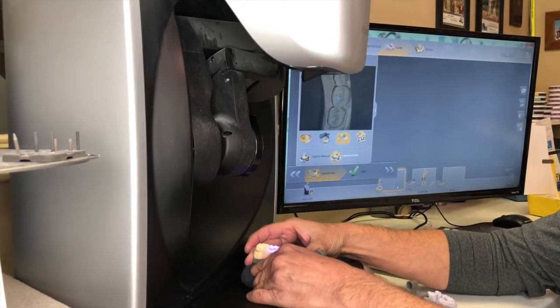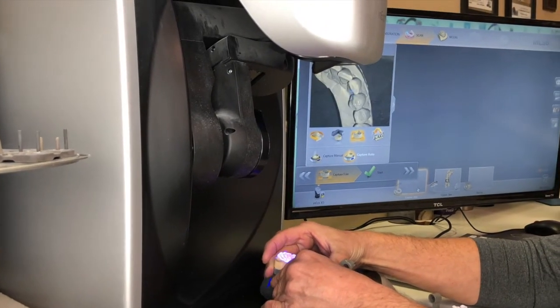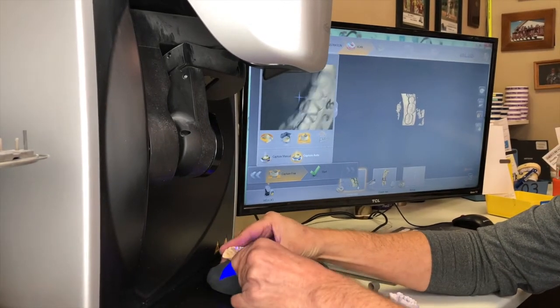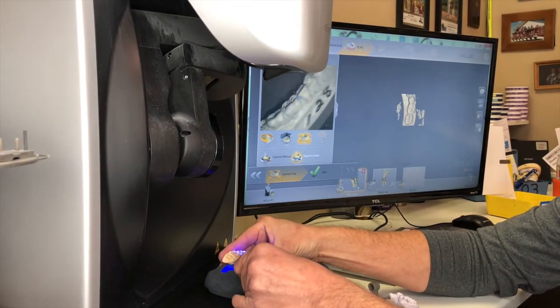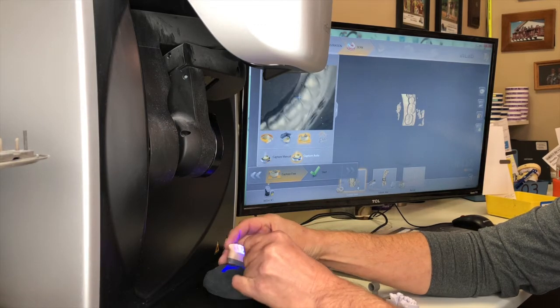Two on the occlusion, one on the facial, and one on the lingual.